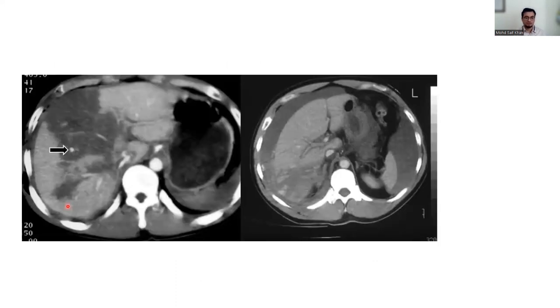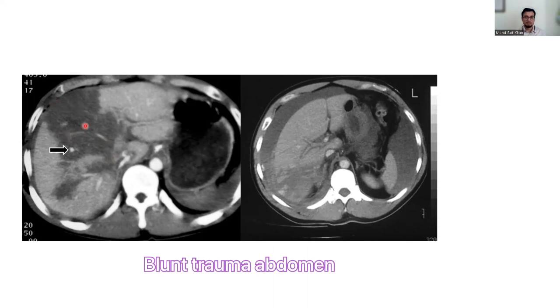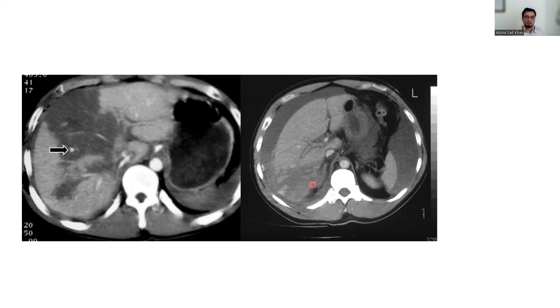In this CT scan after blunt abdominal trauma, you can see hypodensity consistent with hemorrhagic contusion and hemoperitoneum. Another case of blunt abdominal trauma shows fluid around the liver and a crushed posterior part of the liver — this is also a case of hemoperitoneum.